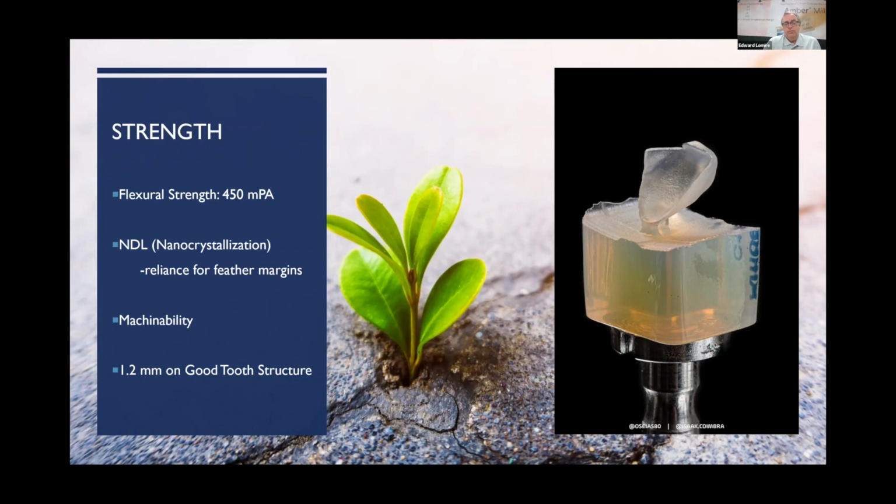My go-to is usually like a 1.2 millimeter reduction. That's kind of standard. Maybe molars, I'll go back and I'll do 1.5. And again, depending from a clinical perspective, look at your patient and how did they break the tooth? Why did it require a crown? Are they a bruxer?